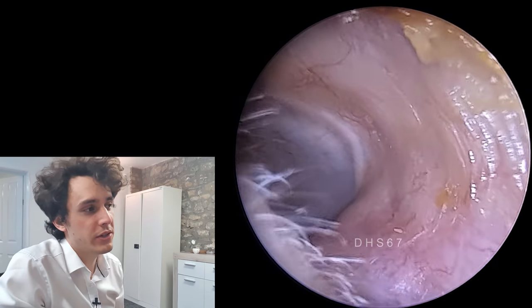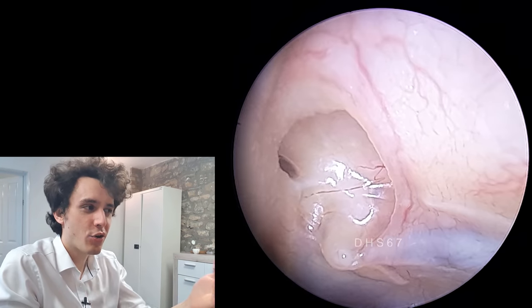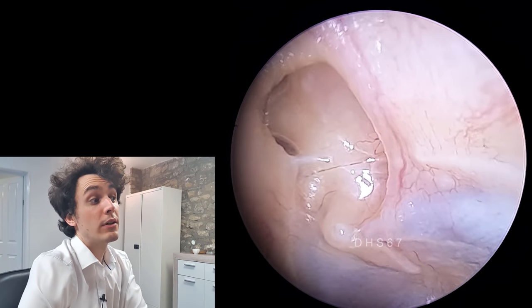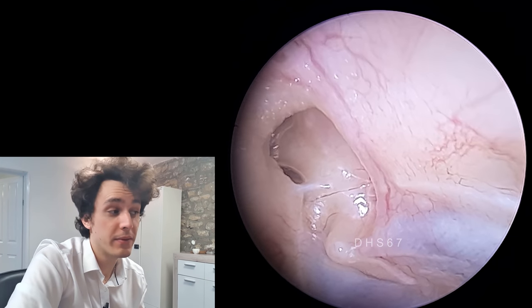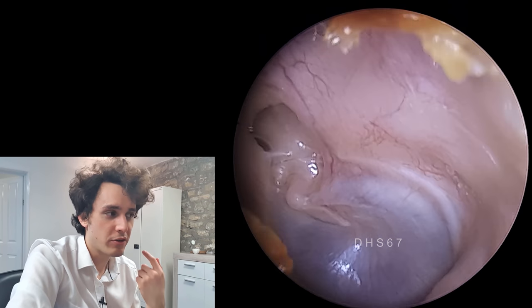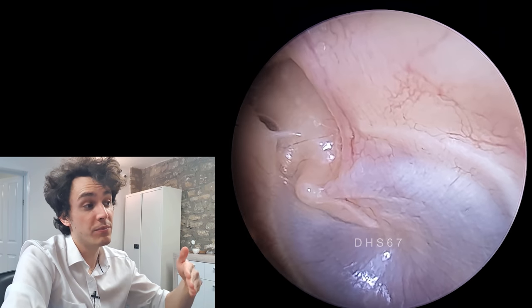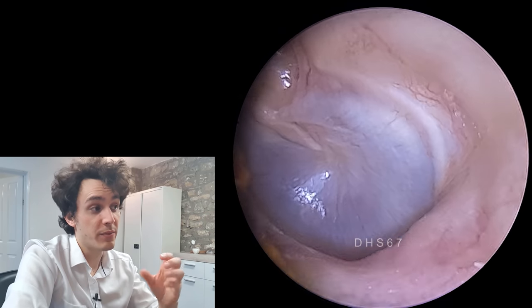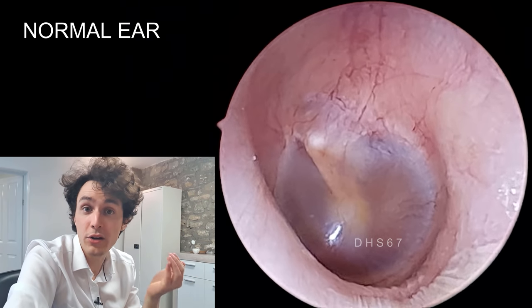Now have a look at this ear — this is extremely concerning. Do you see this kind of pocket, this crater that's just north of the eardrum? This is quite a deep and large retraction pocket. Interestingly, this ear has never had a grommet — this is the ungrommeted ear — but the patient has eustachian tube dysfunction on both sides. Because this ear hasn't been treated with the grommet, that negative pressure has built up for so long that the area just north of the eardrum has been sucked backwards to such an extent that it's created this kind of crater.